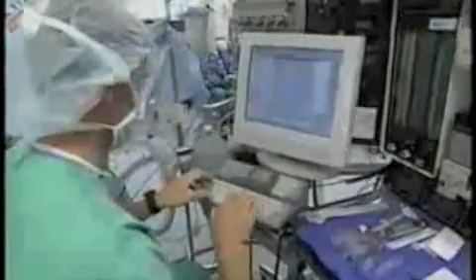The position of devices in a clinical work environment can result in problems, particularly with monitoring. In this case, an electronic record-keeping system is located optimally for use. It blocks the vision of the clinician of a number of the other essential monitors and can often be in the way when the clinician is trying to interact with those other devices. One of the issues you can see very clearly here is they're managing the patient's airway, but they're having to turn 120 degrees behind them to see the monitors.